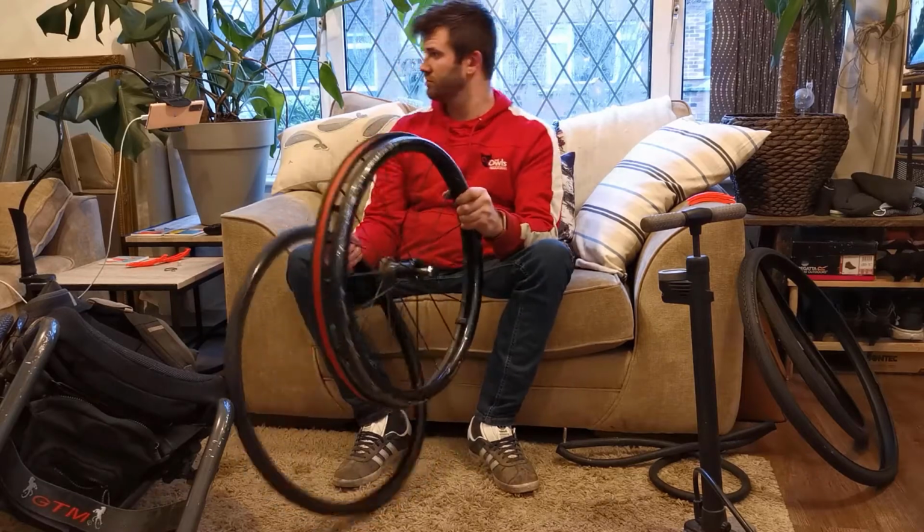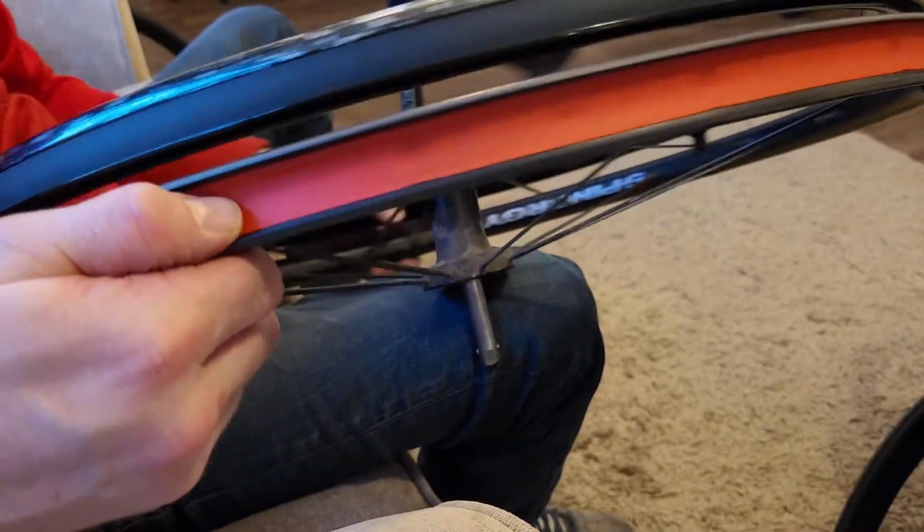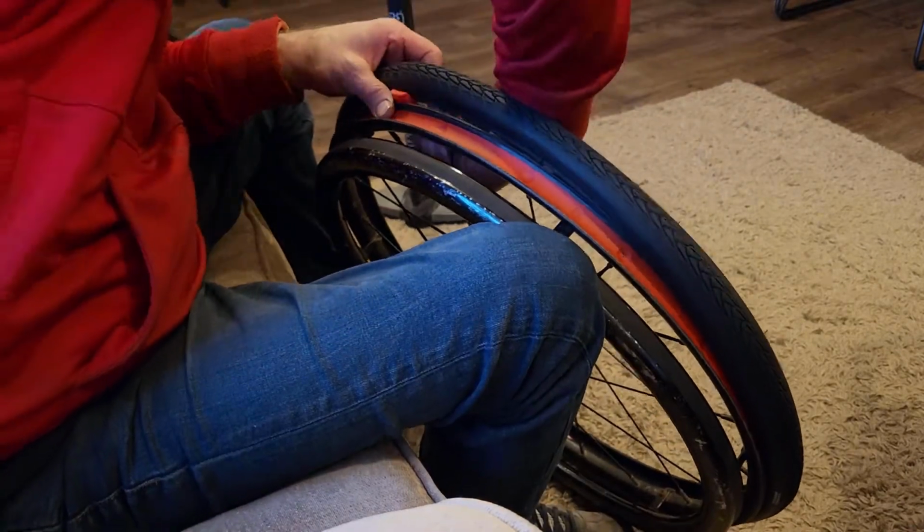It's actually gone through to the blue underneath the exterior, and these tyres are brilliant. They are puncture proof, but if you go over something like a drawing pin, they will still quite likely puncture. That orange tape there is called rim tape, and that's to protect your inner tube from the back of the spokes, which each have a little nut on it, but sometimes that rim tape can go through and cause punctures.